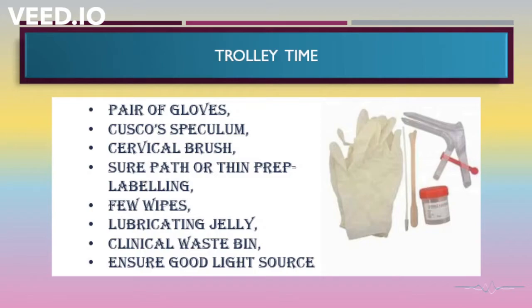Now, how do we prepare for this test? How to perform it? It's very important to have a little time. Identify your instruments, keep them on the side, and then you start. So you will have a trolley. While you're explaining to the patient that she needs to lie down in a certain way, or telling the patient to undress, or arranging for the chaperone, during that time, you might think about what you're going to assemble in your trolley.